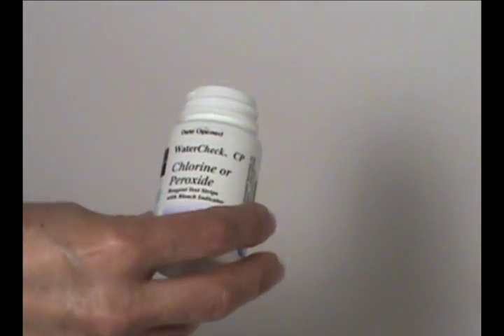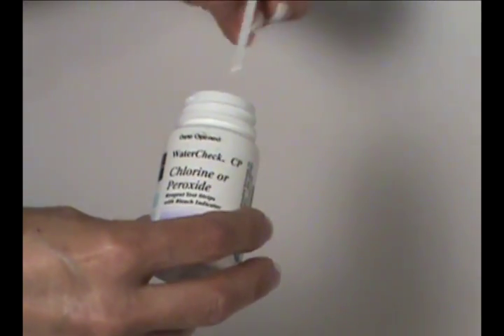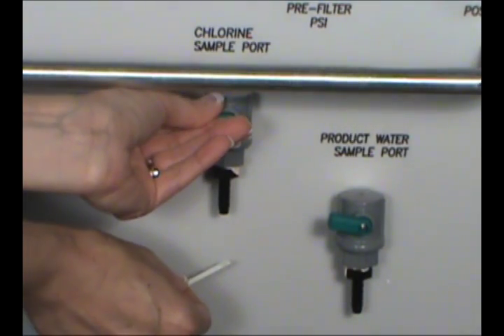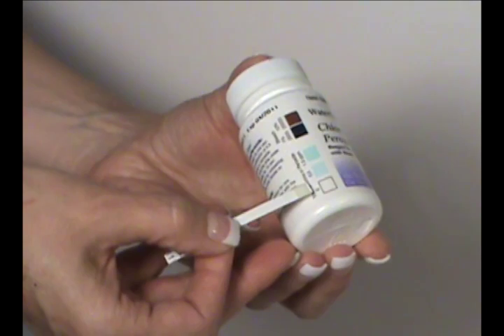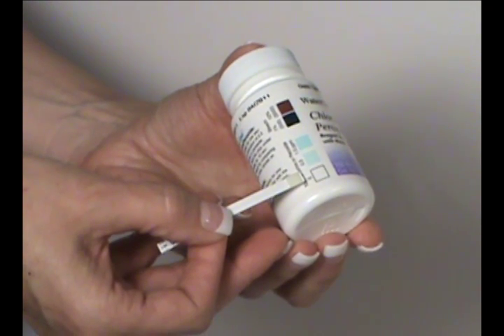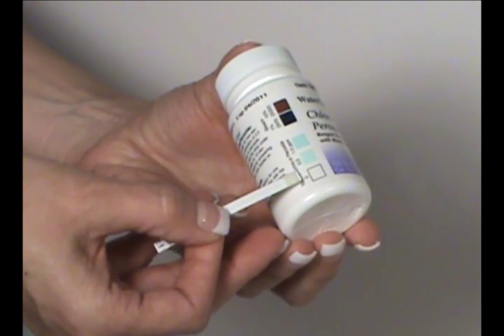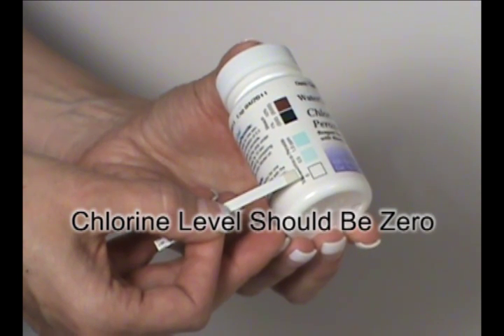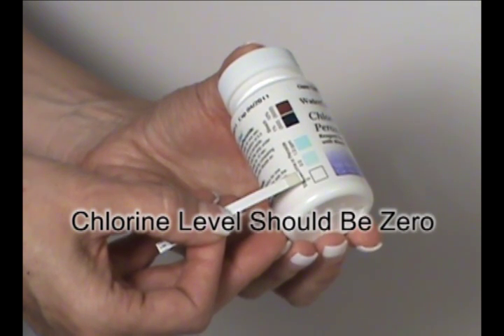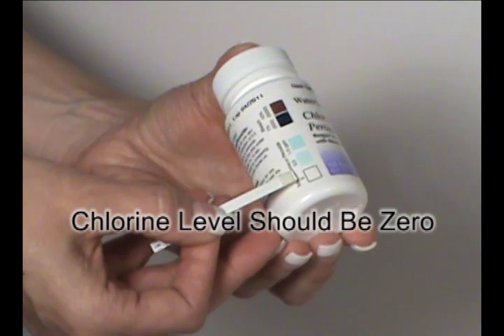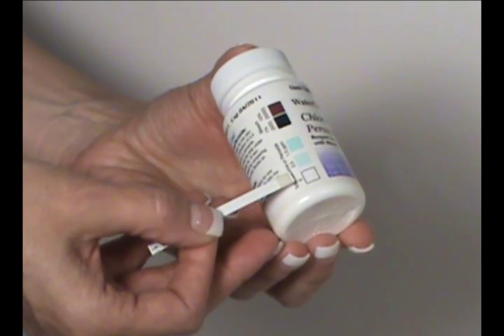Remove a chlorine strip from the container. Wet the sample strip from the chlorine sample port. Compare the color test results on the side of the container. The chlorine level should be zero. If the chlorine level is not satisfactory, the chlorine filters should be replaced.